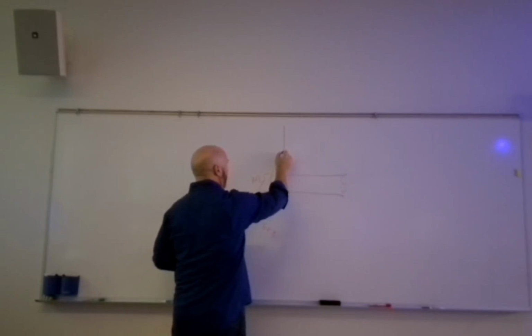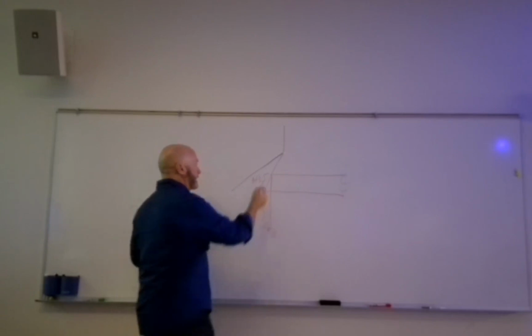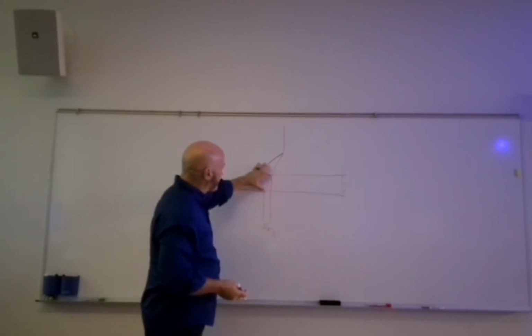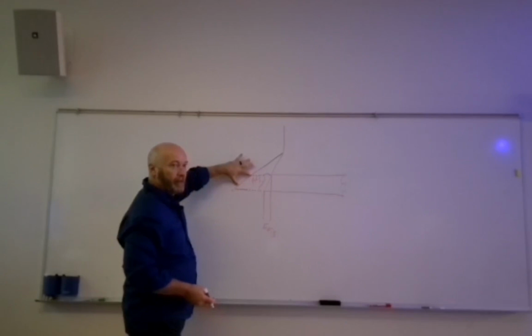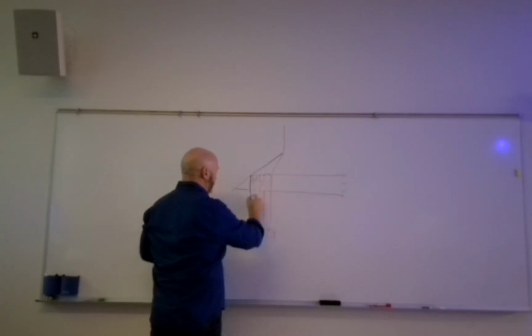So if we flatten this out like that, and we continue our stream of electrons to here, okay, so our actual focal spot here was that big, right? What is it now, in a word? Bigger. That's the word. Bigger. It's bigger, right?